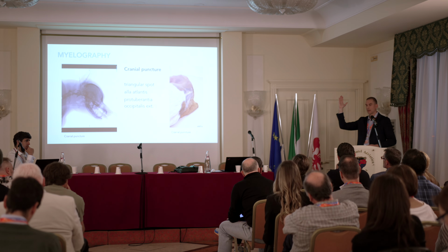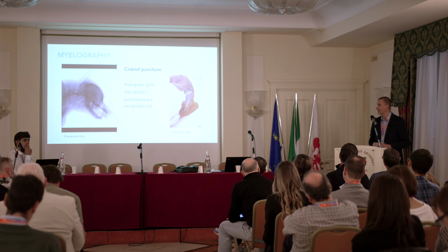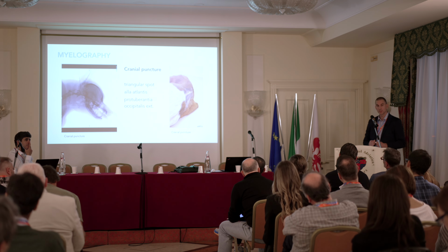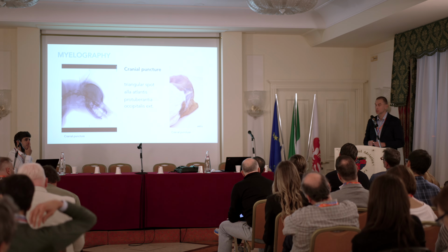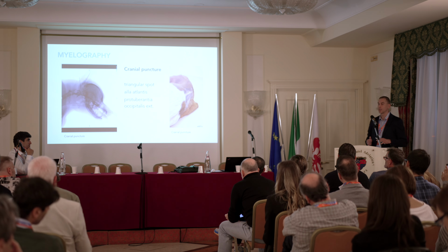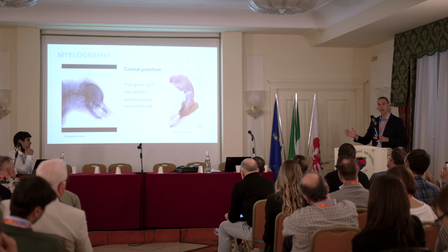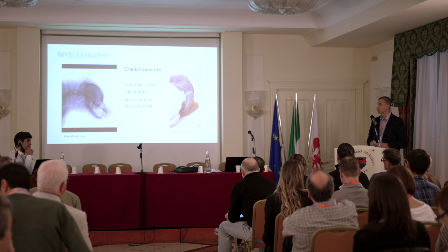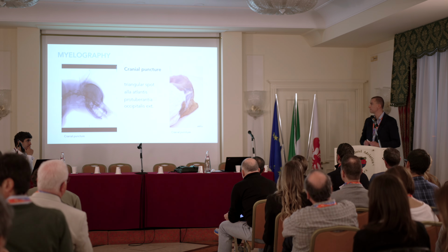The big problem with 40, 50 kilos animals, it's strange, but it helps much. And for those cranial puncture contrast studies, it's necessary to be a little bit patient and wait till the medium is in the channel. So I perform those images usually after 2 minutes after application.